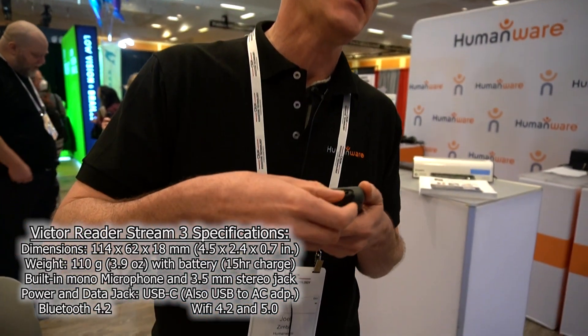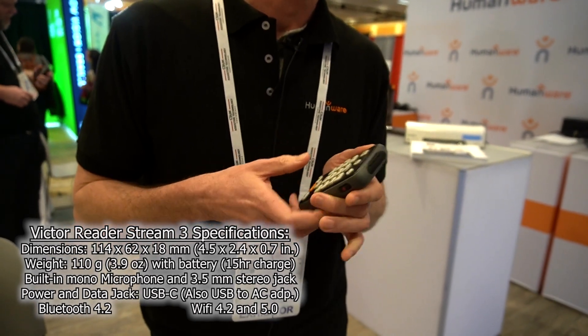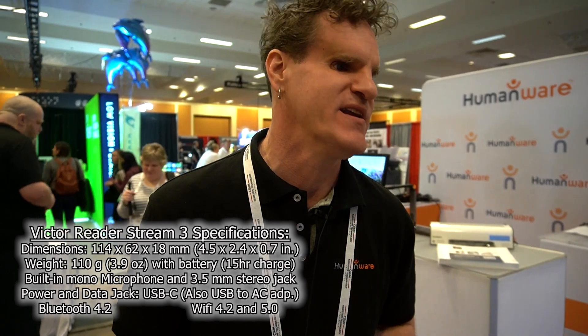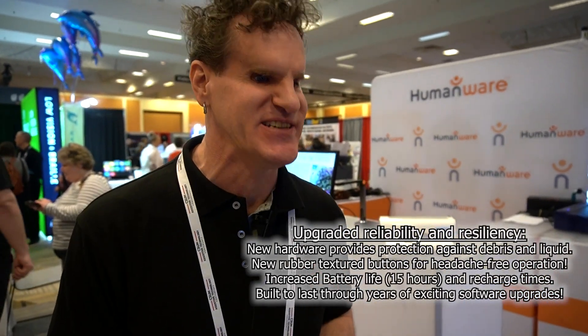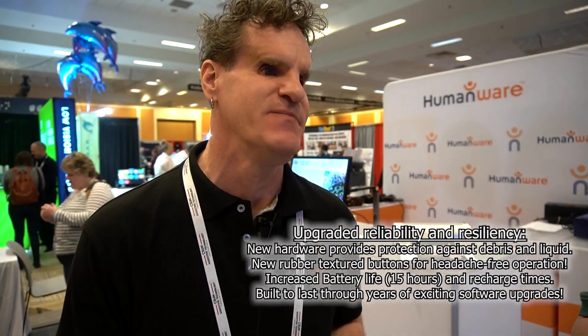That was one of the main failure points of the Stream, as you might know — so we've replaced that, it's much more reliable. It has Wi-Fi 5.0 as well as 2.4, so you can connect to all your Wi-Fi 5 networks. There's a cover over the SD card slot to protect it, and it's unibodied, so it doesn't have the removable battery anymore. Although it feels very similar to the Stream 2, it still has a very unique feel. It looks like it's using more rubber buttons versus the hard plastic buttons of the 2, and they're sealed better — so if you spill your coffee into it, chances are it's not going to be toast.